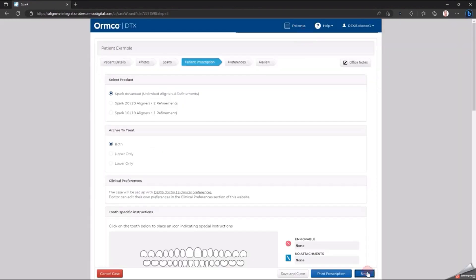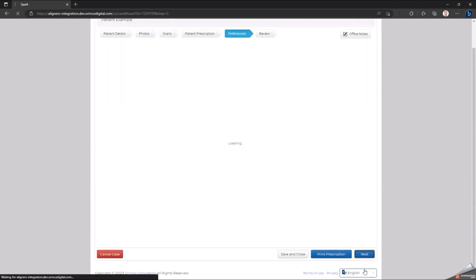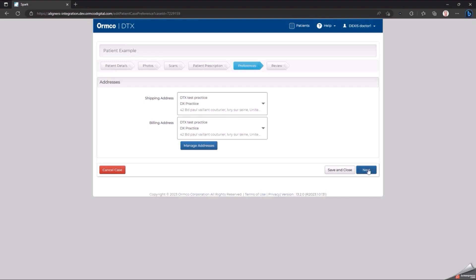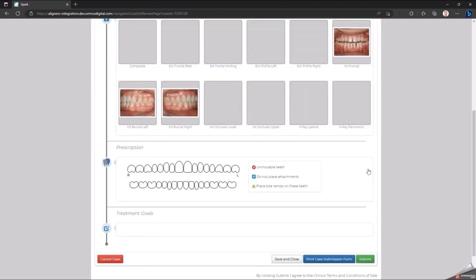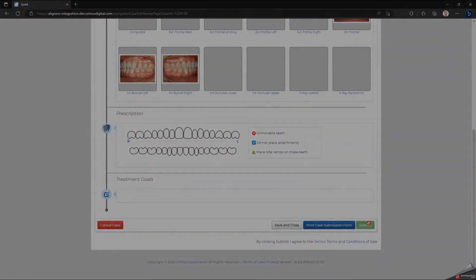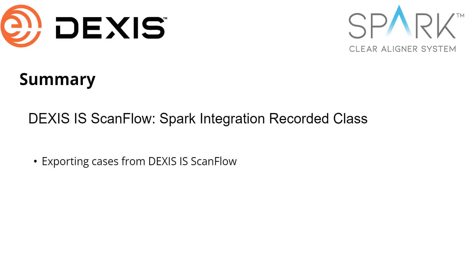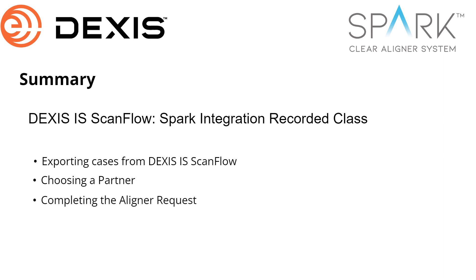Click Next. Complete the prescription and submit the case. You should now be able to export cases to Spark from Dexis IS ScanFlow.